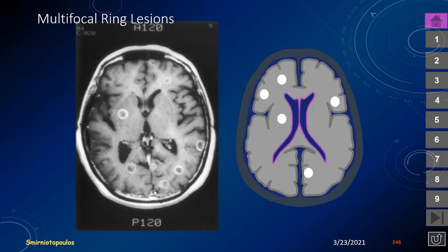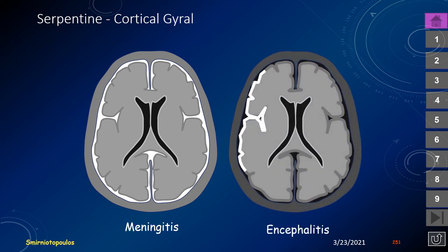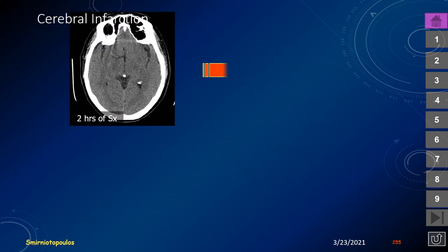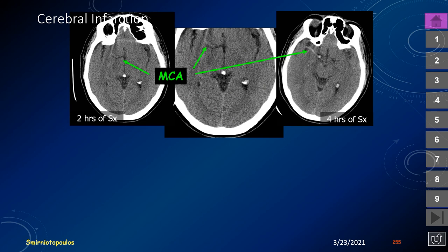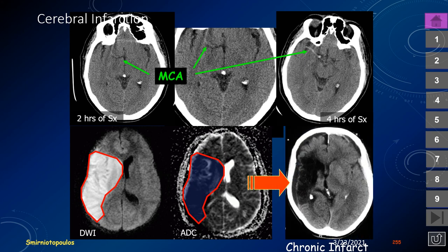Multifocal ring lesions initially thought to represent IV drug abuse were found to be metastatic breast cancer undergoing active chemotherapy — the chemotherapy successfully killing the embolized tumor. We can also have gyral or cortical enhancement and meningitis producing superficial enhancement. Cerebral infarction presents with acute onset of symptoms; CT may show the hyperdense middle cerebral artery sign, with matching diffusion restriction bright on DWI and dark on ADC. Untreated infarction progresses to atrophy.